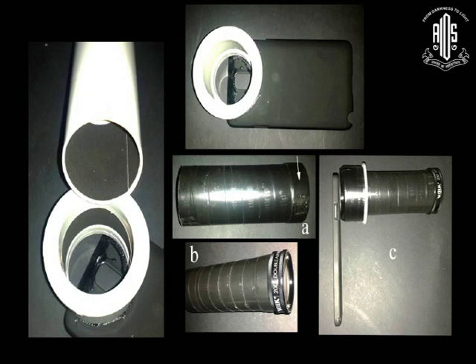And this is the way it is done. You have a smartphone hard back cover onto which a pipe reducer is stuck with glue. And there is an optical tube, just a 50 mm pipe, around which you wind some insulation tape to fit a 20 diopter lens, and it fits well. And this optical tube can be mounted onto the reducer. The phone is kept inside the back cover, and you have your handheld device ready.